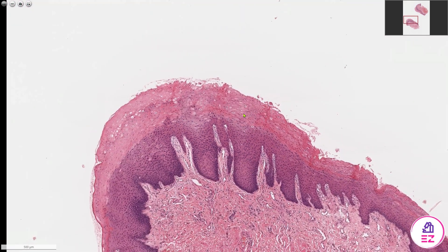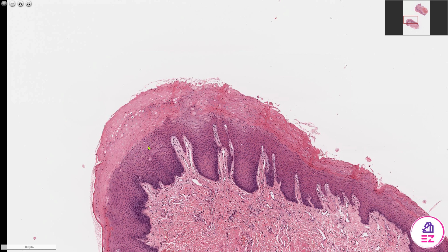We can also see that the rete pegs are elongated. You could also describe them as being hyperplastic, or better still, acanthotic, because we have an increase in the prickle cell layers. So you can use any of those terms, really.